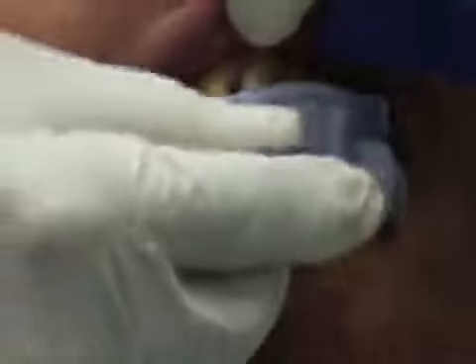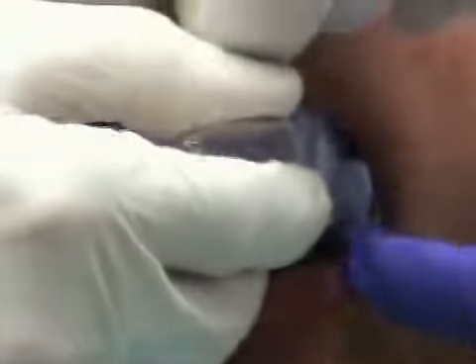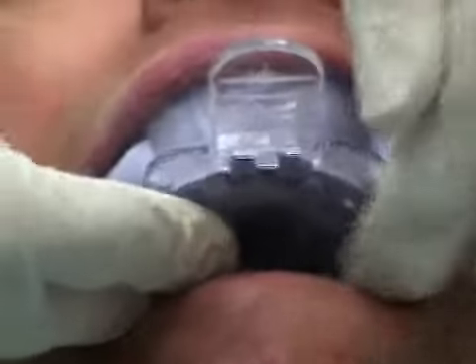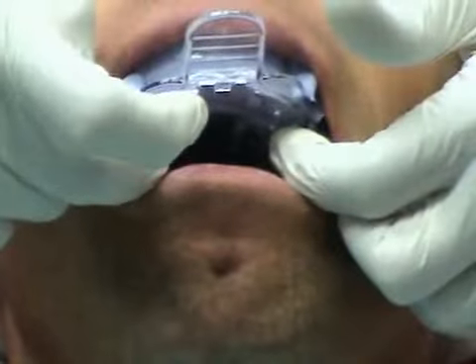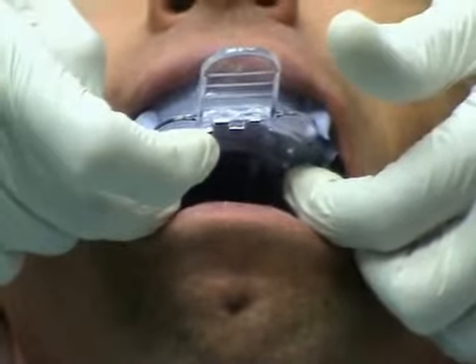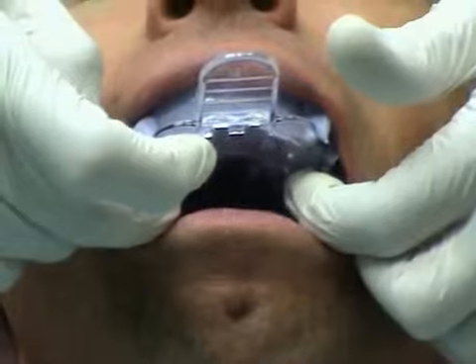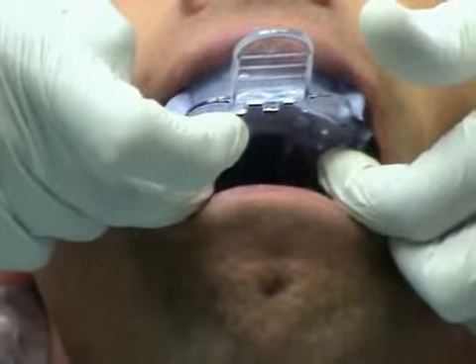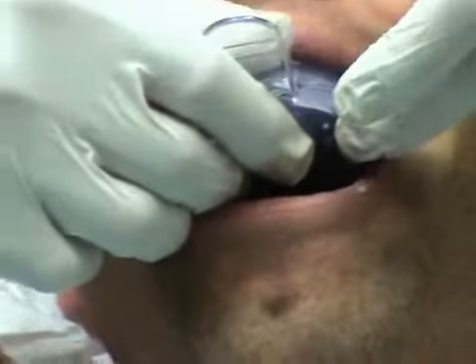Reposition the matrix in the mouth. ProTemp Plus attains a hard elastic consistency within 1 minute and 40 seconds from the onset of mixing. The material can be removed from the mouth at any point between 1 minute 40 seconds and 2 minutes 50 seconds from the onset of mixing. It is important not to remove the material before this point.